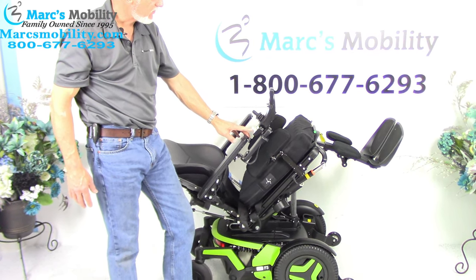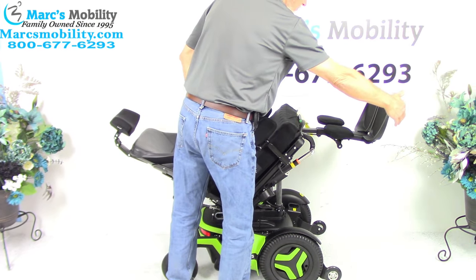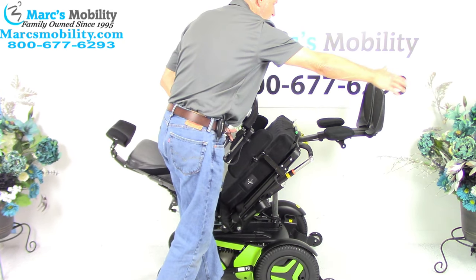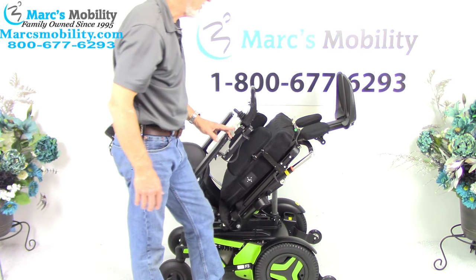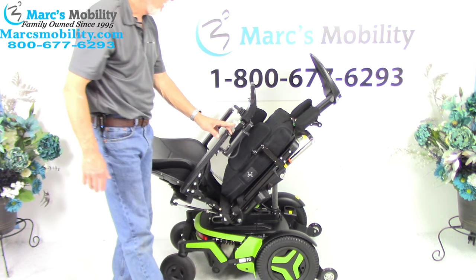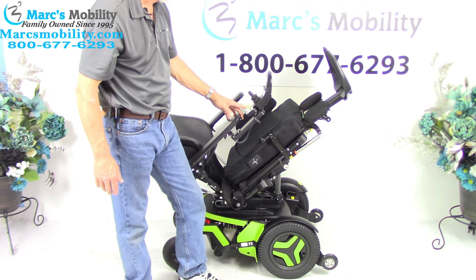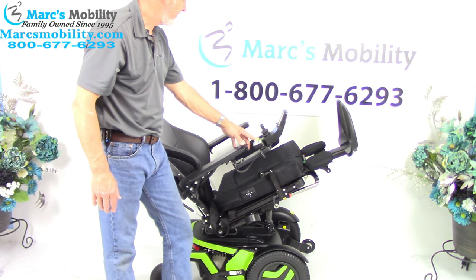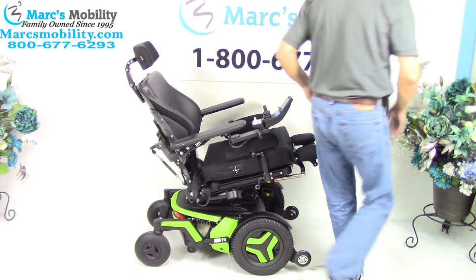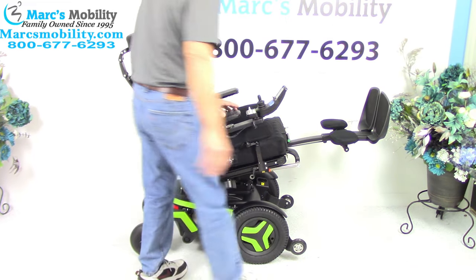The next feature I'm going to show you is called the electric legs. Now these legs are electric but they can also be pushed out or brought in depending if you're five feet tall or six foot two — we can adjust the length on these legs. So if you needed some good circulation, this would be extreme, but you could be halfway tilted and still have good circulation because your feet would still be higher than your body.